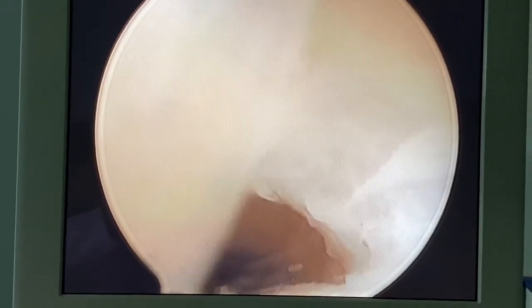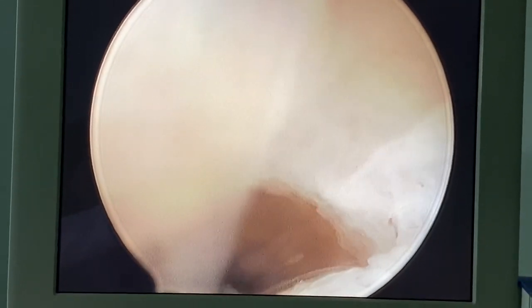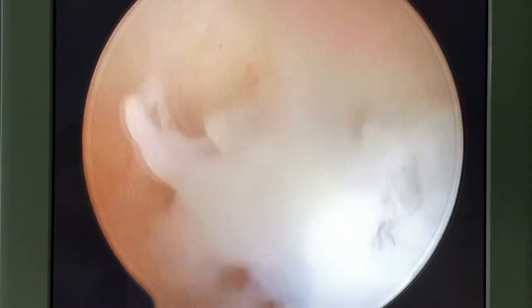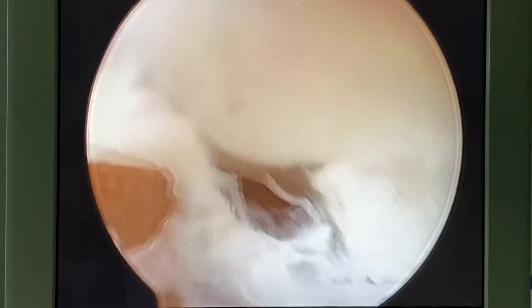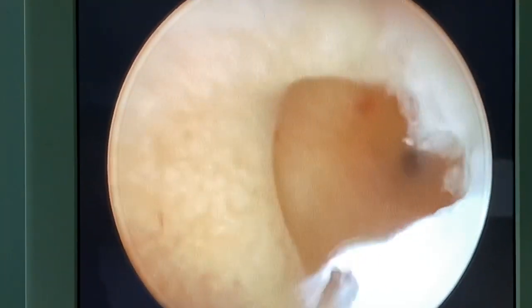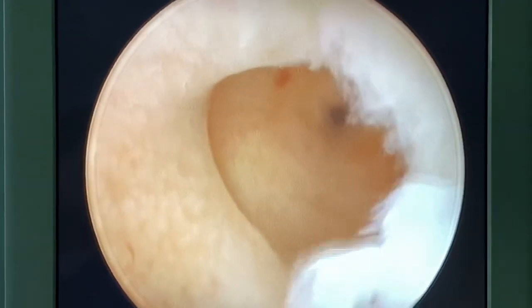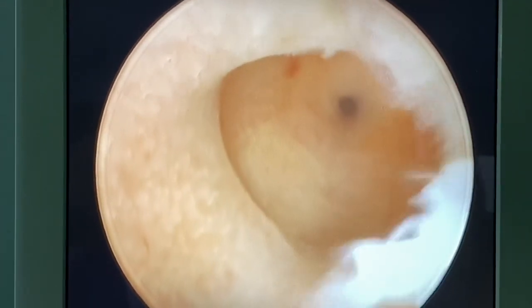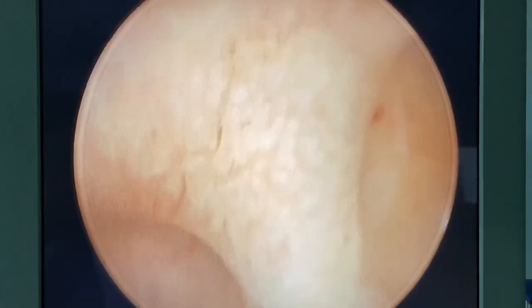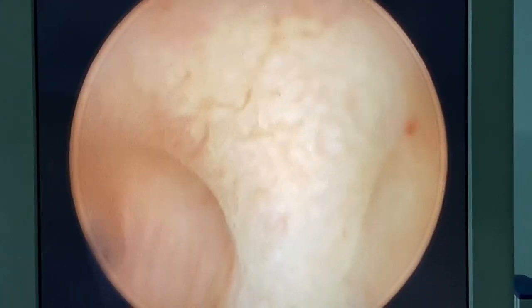Once you're in, you have to readjust the focus. Now I am inside the cavity — a little friction happened. You can see residual septum inside. That's a residual septum. And there are some ostial adhesions on that side.